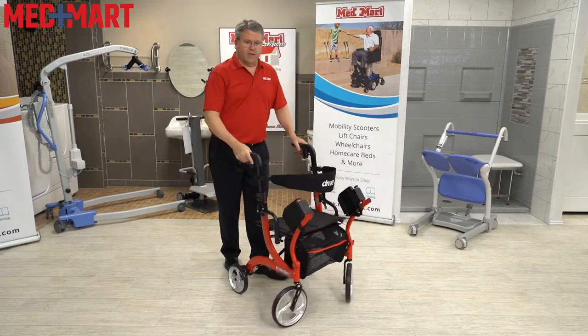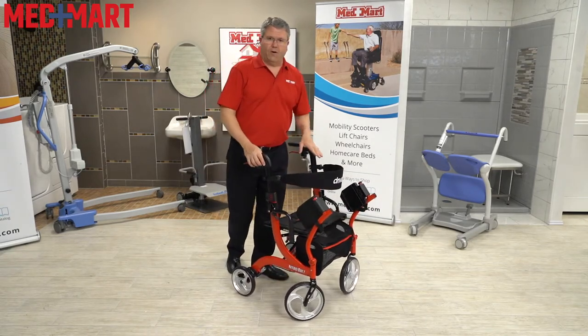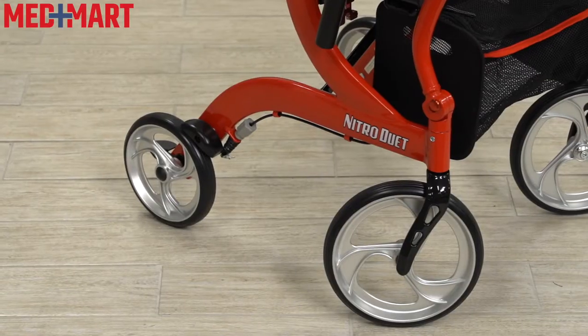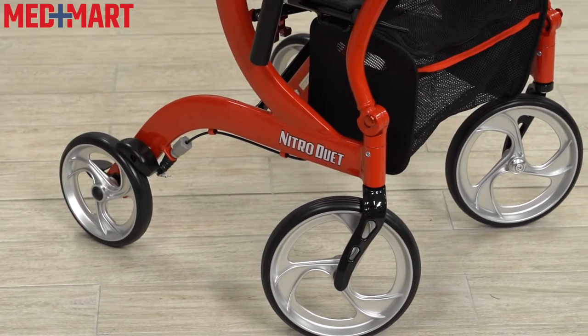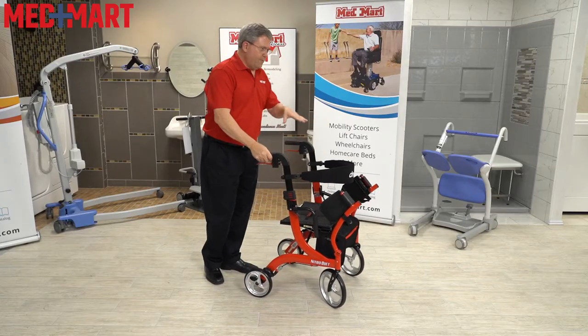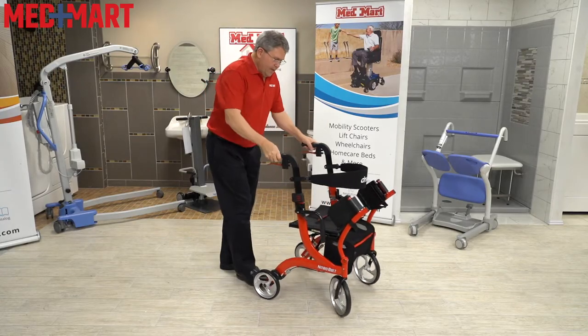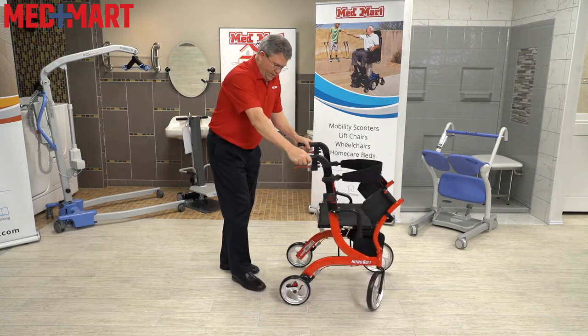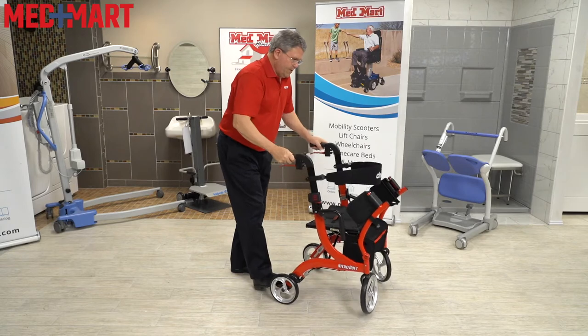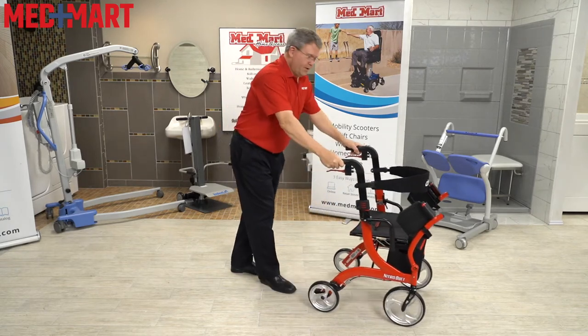This basically combines the transport chair and a walker together. Let me show you first how to use this as a walker. It has 10-inch oversized large front wheels, which makes it easy to help navigate over small items — maybe a small curb or a couple of irregularities in the concrete. Also, you do have a little stepping place here that allows you to step and lift up the walker a little bit to help you get over small items.